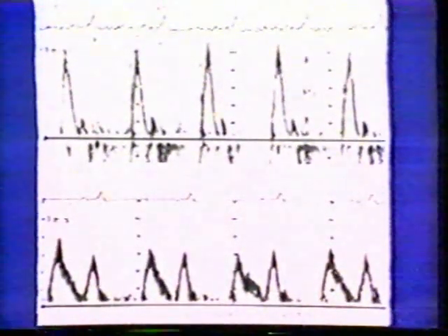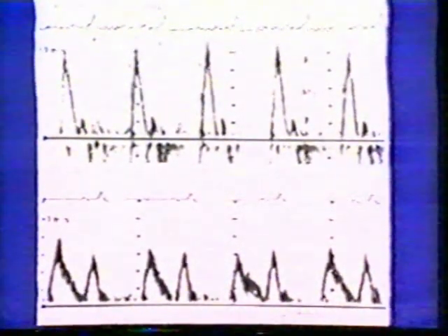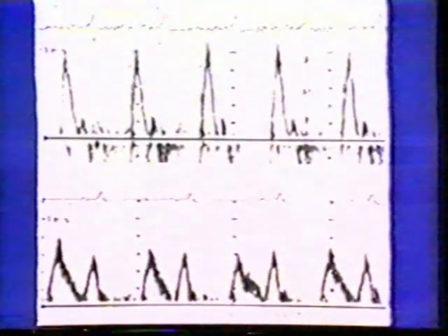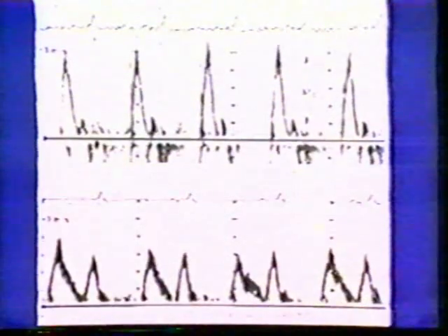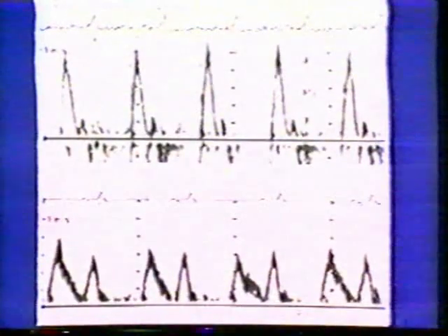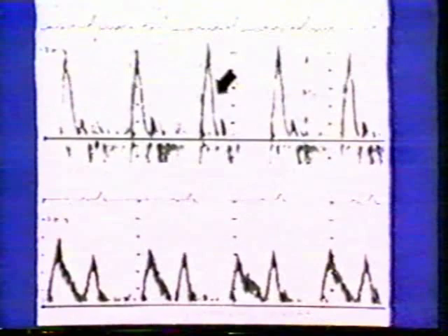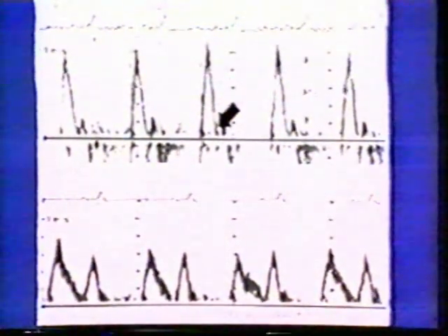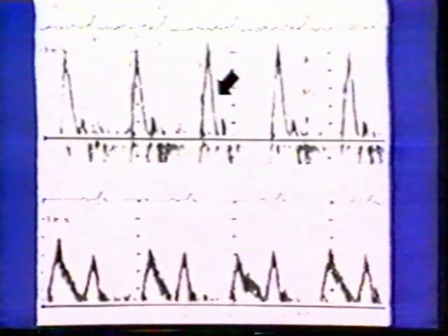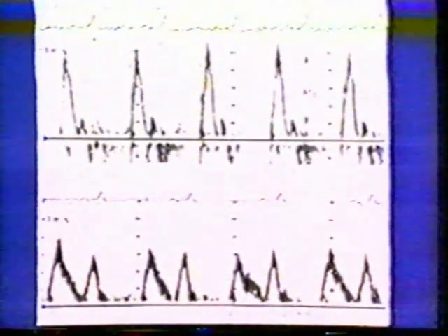This is the pulsed wave examination from another patient with severe aortic regurgitation. As previously mentioned, severe degrees of aortic regurgitation cause a rapid and marked rise in left ventricular diastolic pressure. This not only contributes to a shortened pressure half-time of the aortic regurgitant signal, but also causes a marked decrease in the deceleration time of mitral inflow. The deceleration time here is 85 milliseconds. Normal for adults is greater than 160 milliseconds.